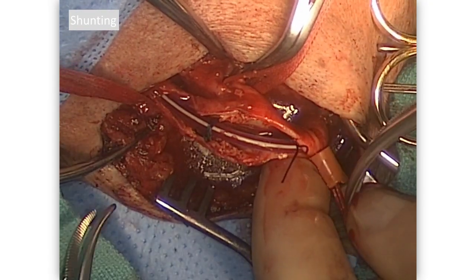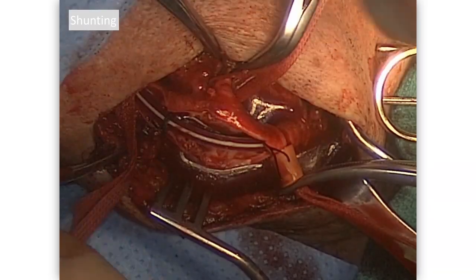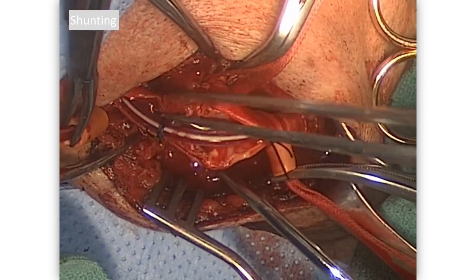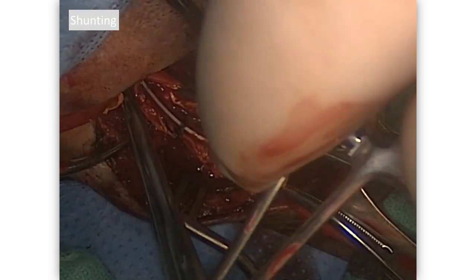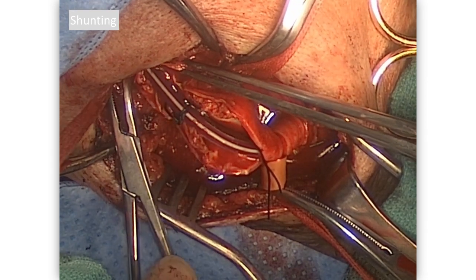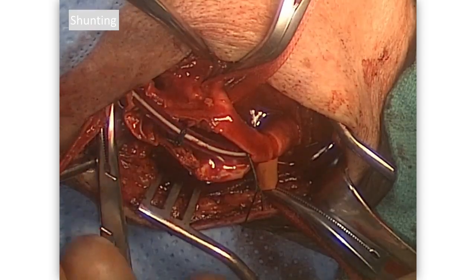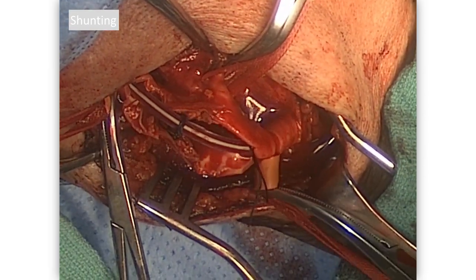At this point I use a hemostat to collar this down and control any bleeding. Sometimes you don't have to put the collar on the distal end, but if there's back bleeding you may have to. Sometimes just pulling it up and snapping the tapes down onto the drapes is enough to control it. We were having a little trouble getting confidently above where the plaque was, so I'll put a clip or hemostat just to stop the bleeding. Shunt's in, there's red stuff in the shunt — but that doesn't always mean it's working. How do you know it's working, and what steps will you take to make sure?